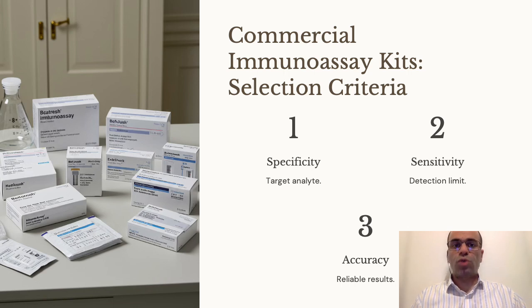Additional factors to consider include precision, which is reproducibility of results, range, a span of concentrations that can be measured, stability, that is shelf life and reagent durability, and value. Value is the last one. Value is the cost relative to performance. These are other factors that must be mentioned. And always evaluate manufacturer validation data and peer-reviewed literature when making your selection.